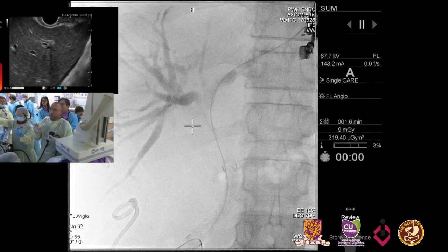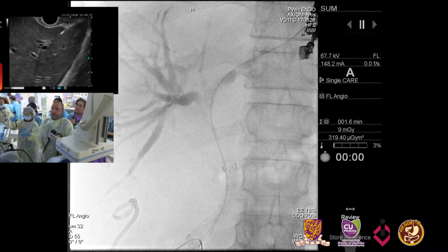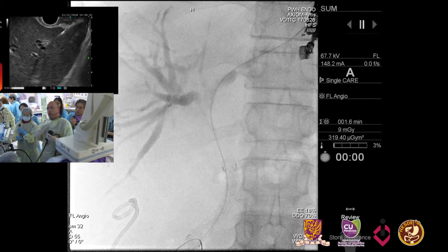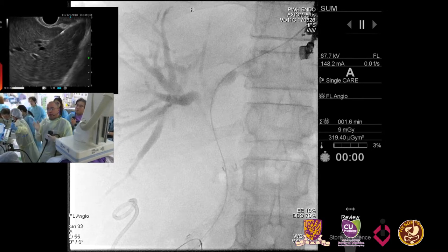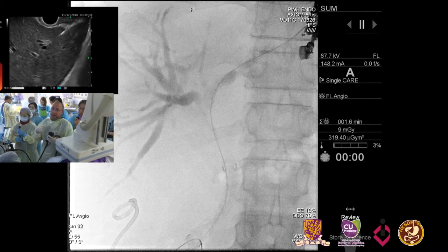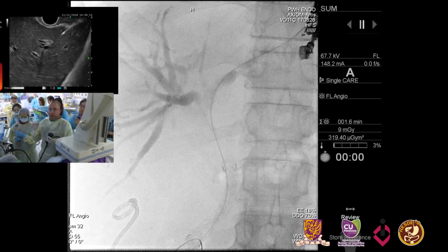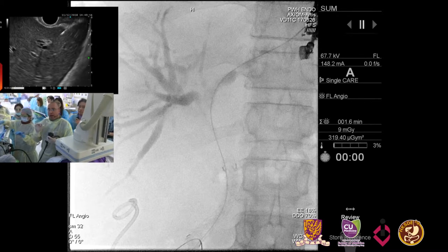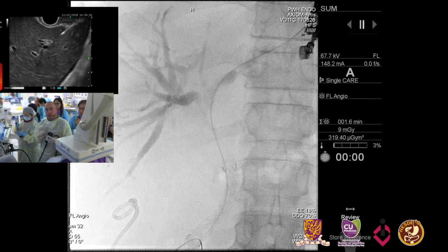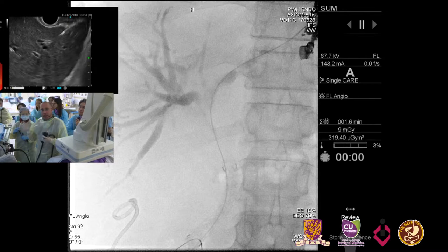So here, a couple of important points, which are very essential for endoscopic interventional EUS. You have the EUS image still, and you can see the wire. We want to insert the balloon into the intrahepatics over the wire under EUS guidance. That's our puncture angle with the 19 gauge. As long as we maintain that, we should be able to access it bluntly with a balloon without needing cautery. The other thing is we're going to dilate that tract to 4 millimeter. So we don't want to be waiting 5 minutes for the stent while there is biliary leakage.